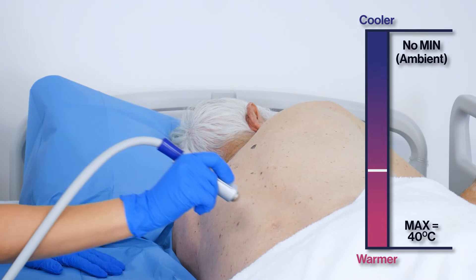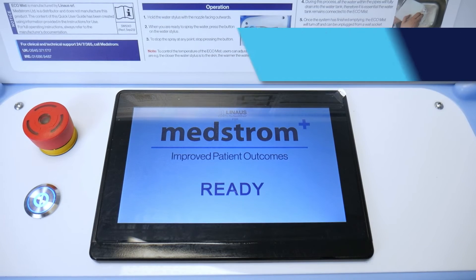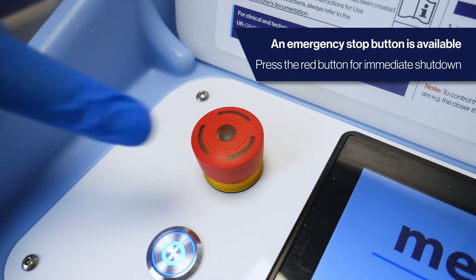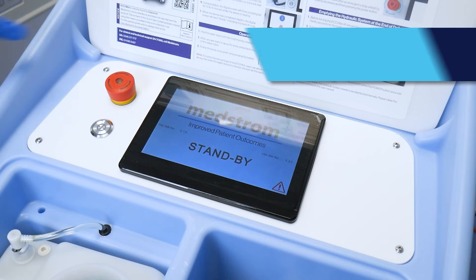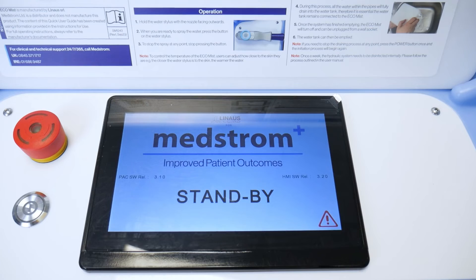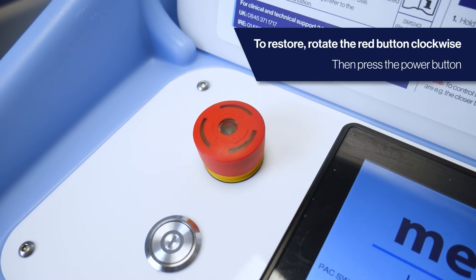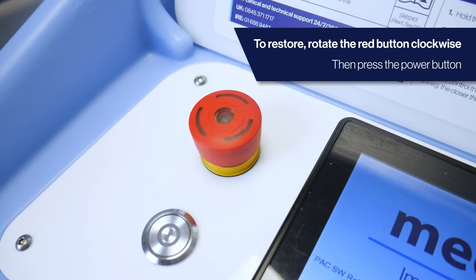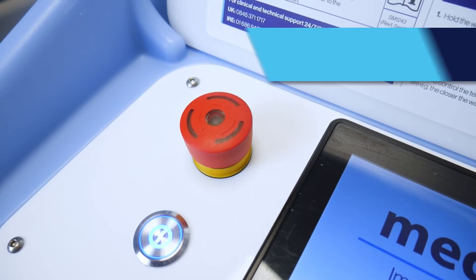In the event of an emergency, the EcoMist is equipped with an emergency stop button. Push the red button to initiate immediate shutdown. During this time, the screen will read 'standby' and the system will not operate. To restore operation after an emergency stop, rotate the red button clockwise and then press the power button.